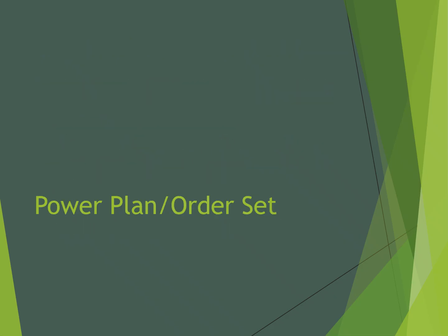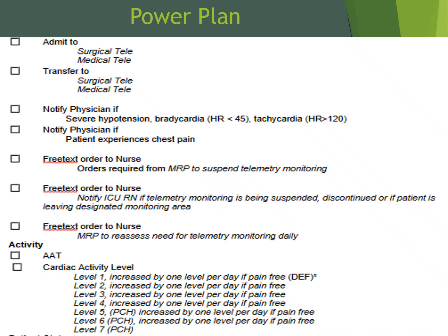appropriate. The next few slides will review the power plan and order set developed for the use of satellite telemetry monitoring on an inpatient unit. These are all the options that will be available in the power plan.